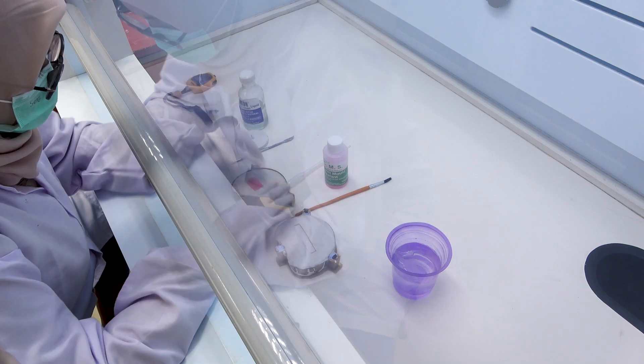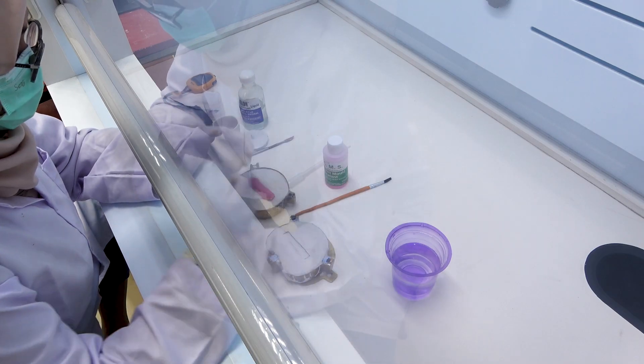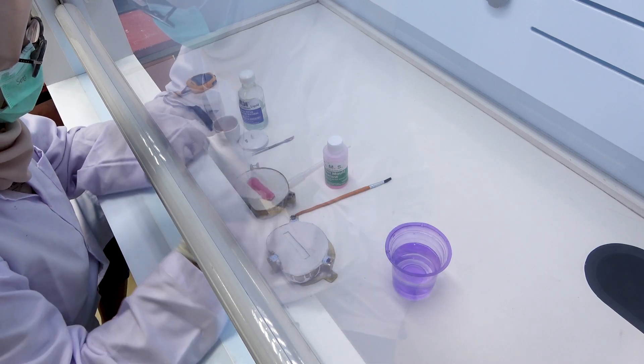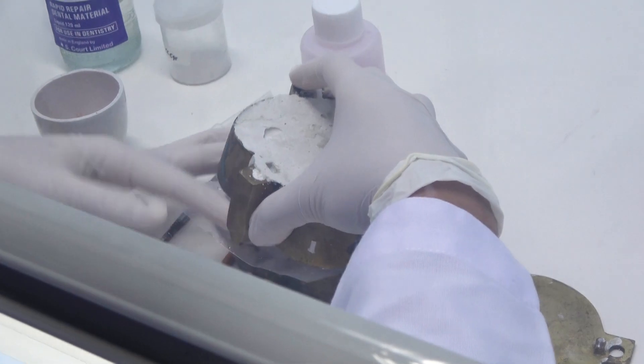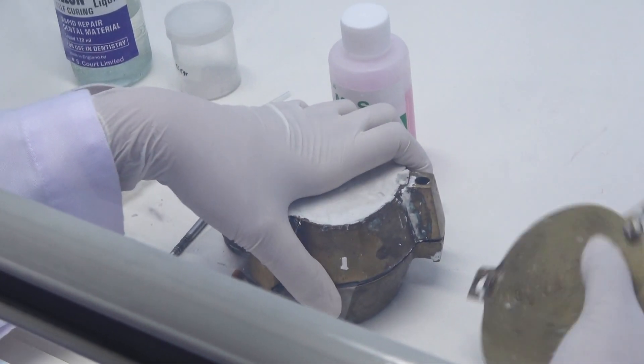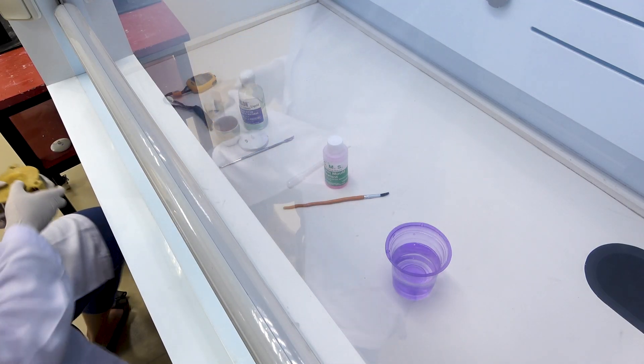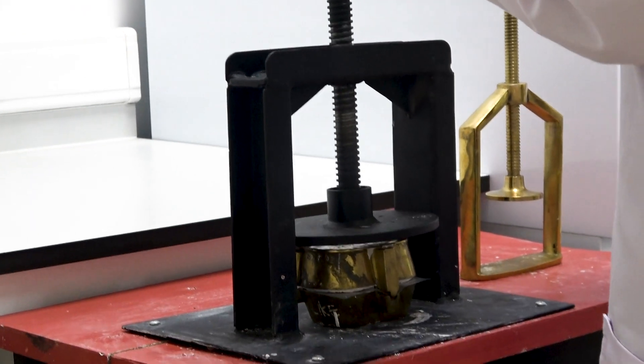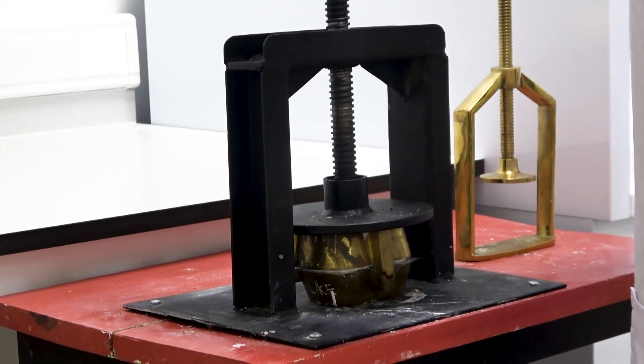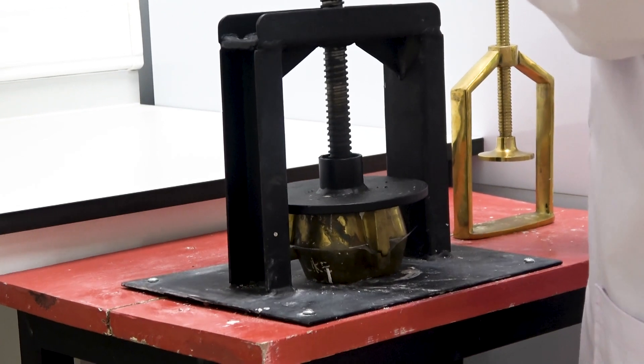Next, place the mixture into the mold on the flask until full. Then cover with water-moistened cellophane plastic. After that, close the flask with the upper flask, but the upper and lower flask should not be too tight.